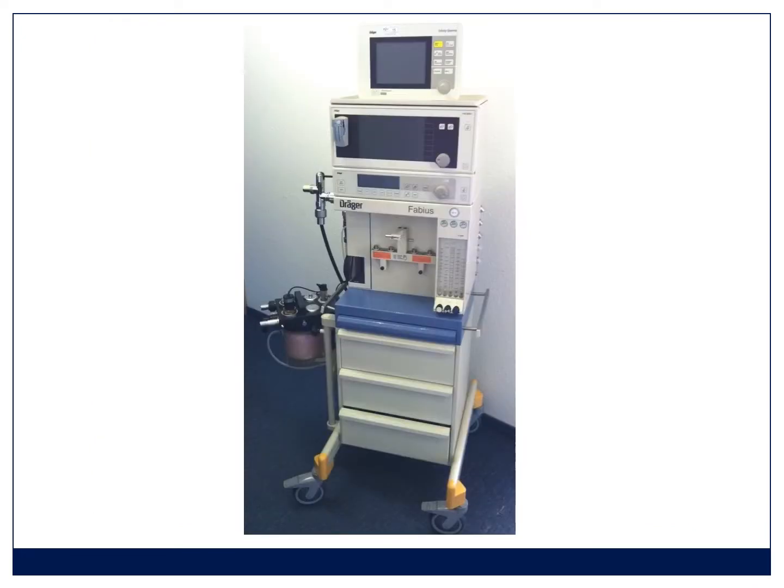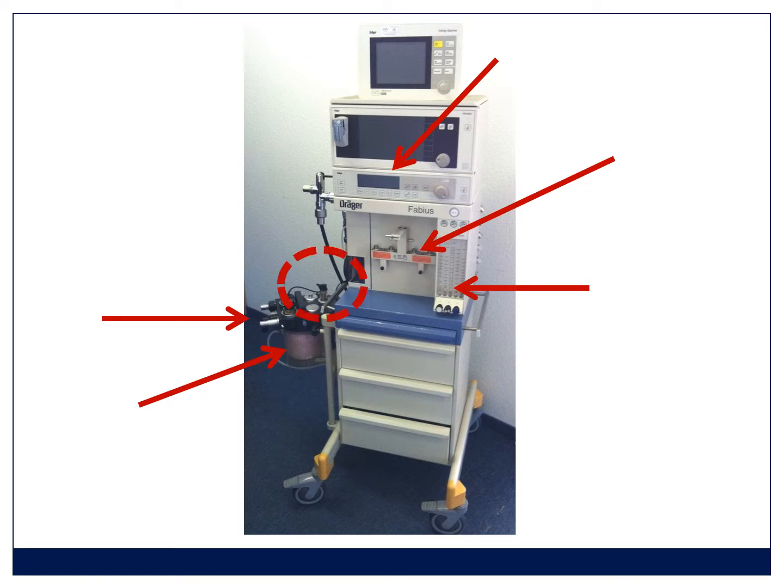Finally, you just have to get to know the anaesthetic machine. Again, the full machine check, really just 1 or 2 of you must know how to do this, but a basic check you really need to be able to do. And if you look at this machine, I've talked about this in one of the other talks as well, there's no circuit, the soda lime is exhausted, there's no power to the machine, that actually catches people out, there's no vaporizer, there's no gas connected, and the APL valve is not checked. So these are the sorts of things you want to be able to do. Those elements you should be able to check.